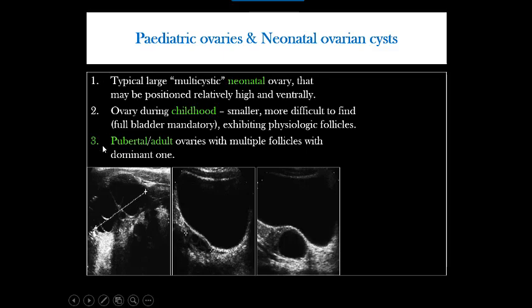Normal ovaries pass through three stages. The first is the neonatal period — due to passage of maternal hormones, the ovary becomes larger in size with large follicles about one centimeter, easily detected by any probe. After the first few weeks it goes into a silent phase: smaller follicles, smaller ovary size, difficult to detect — needs a window like a full bladder. During puberty it may simulate an adult ovary with multiple follicles, a dominant one, and ovulation.